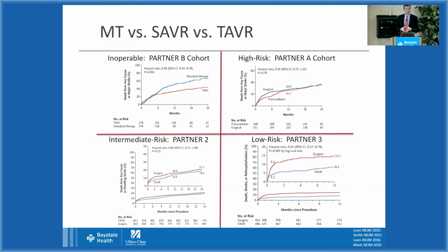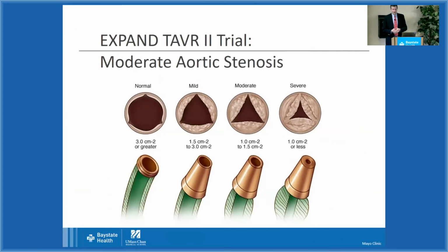So what if you don't have the most severe valve blockage? What if you have a moderate valve blockage? Well, in the era when valve replacement was really a big deal, open heart surgery, long time in the hospital, you wouldn't think about replacing a valve in somebody who didn't have really severe blockage. But now, it's a reasonable question. And it's being asked by a major trial in which we're participating at Bay State. And that trial is called Expand TAVR 2.